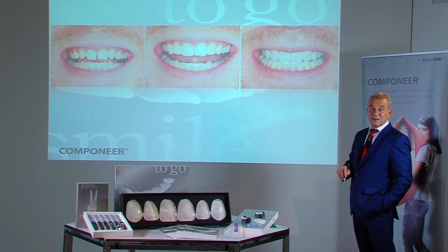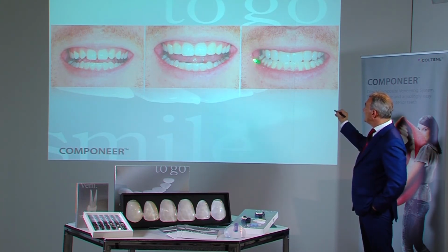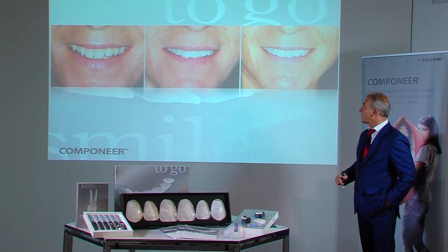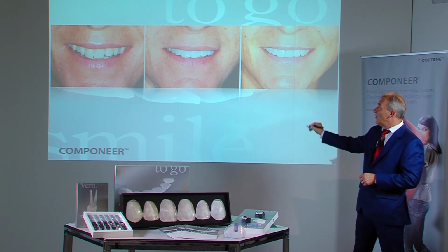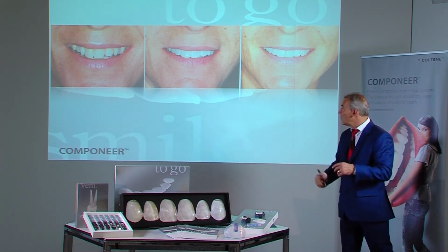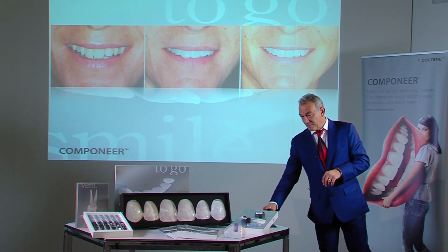We start with the initial situation. This is followed by the diagnosis, where we apply composite and make a model. Then we have the final situation with the smoother and more attractive surface, naturally, the way it should be. In this initial situation, we can also see the bow-like incisors and the sunken cuspid, which makes the entire dental arch appear somewhat unruly. Here you can see the diagnosis, and in the final outcome, the whole situation has been rounded off.